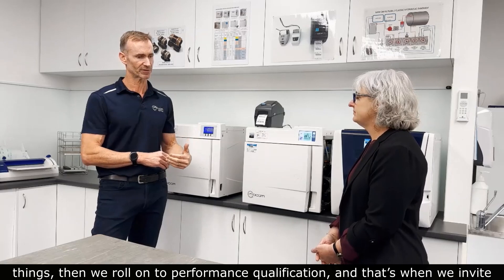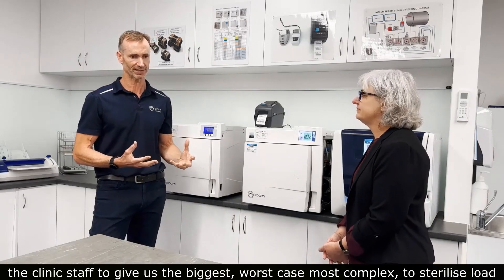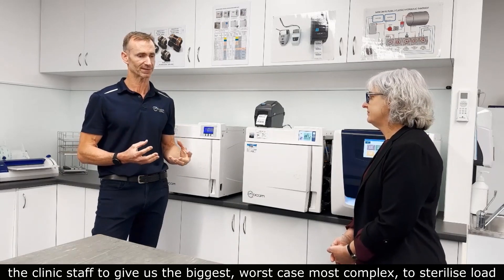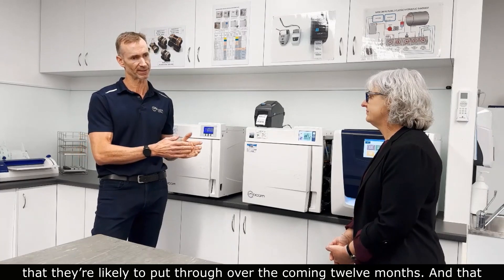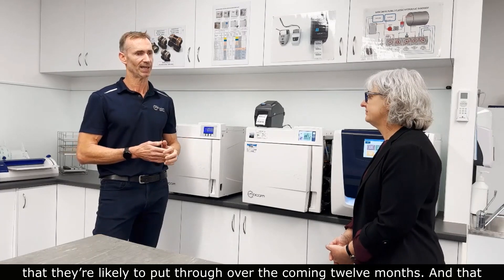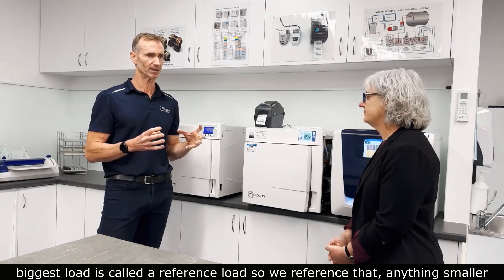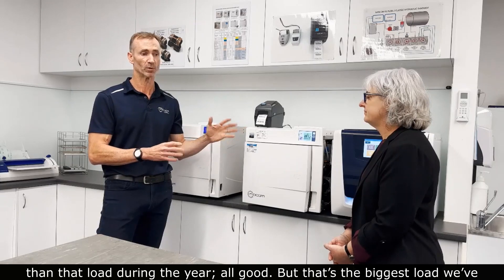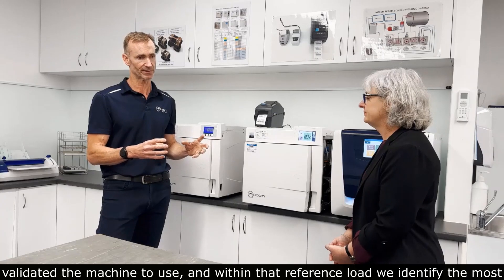Performance Qualification is when we invite clinic staff to give us their biggest, worst case, most complex load that they're likely to put through over the coming 12 months. That biggest load is called a reference load. Anything smaller than that load during the year is fine, but that's the biggest load that we've validated the machine to use.